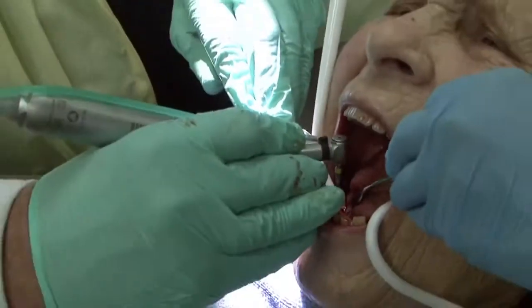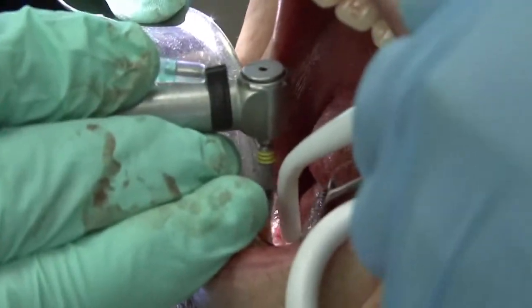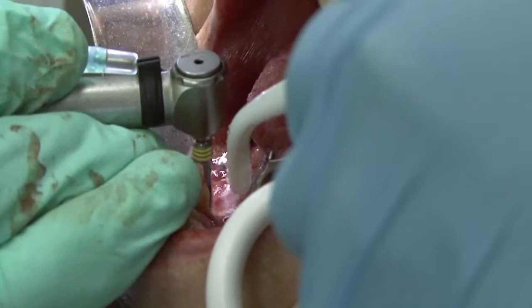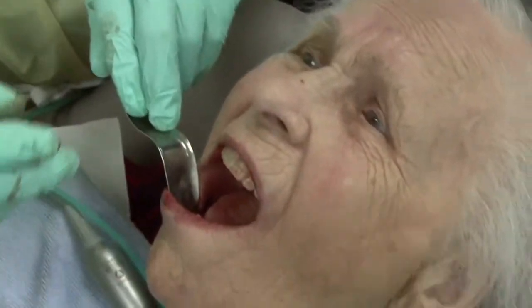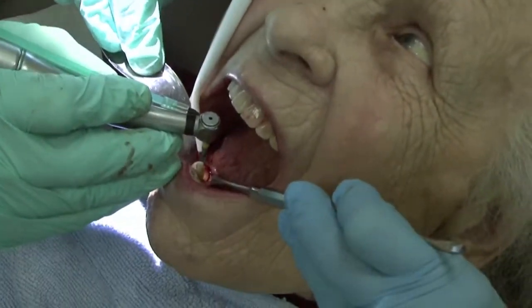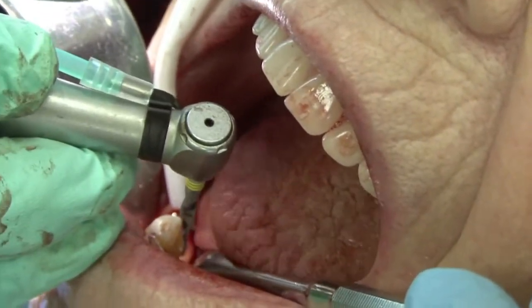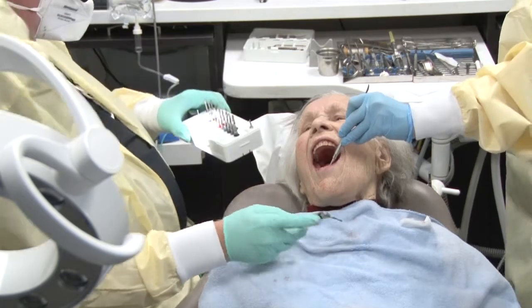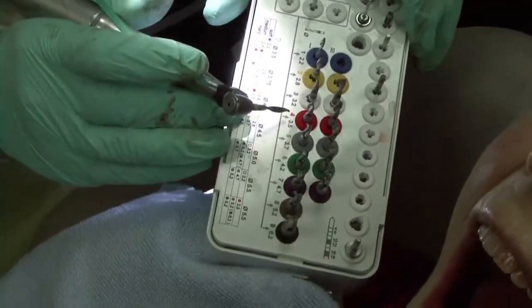Okay. So now you can see we've lined it up just a little bit towards the distal. Okay, so the decision has to be made if we're going to go with a diameter of 3.5 or 4 millimeters. It looks like we could definitely go with a 4 if we moved in just a little bit. So if we went with a 4 millimeter diameter, using the BLX kit, we would want to go up one, and we would be using a 3.2 millimeter diameter burr. So that's what we're going to do.